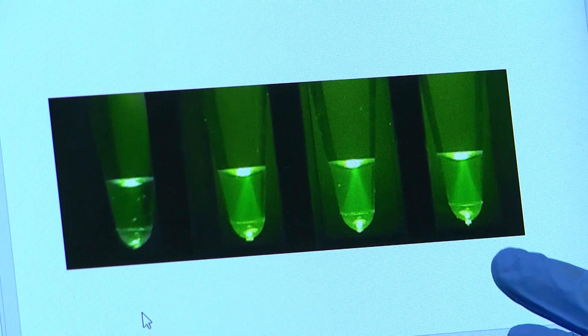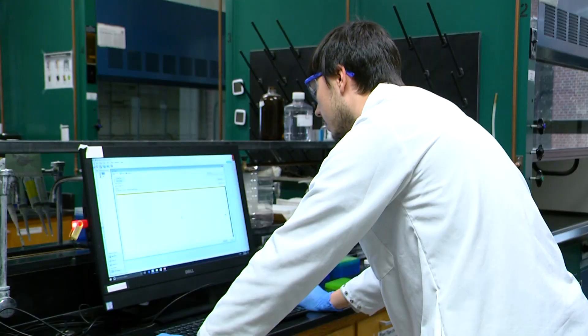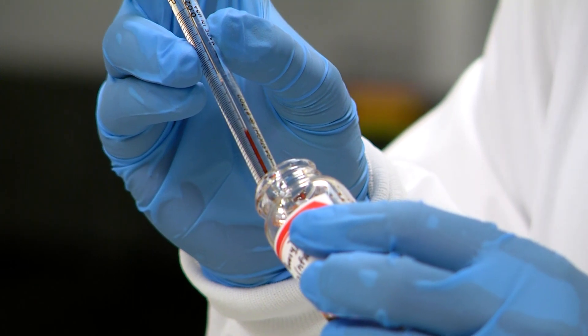One of the big challenges in analyzing bacterial contamination within foods is having a method that's very rapid. Traditional methods typically involve culturing the bacteria captured from a food sample, and this can typically take days in order to get a positive result.